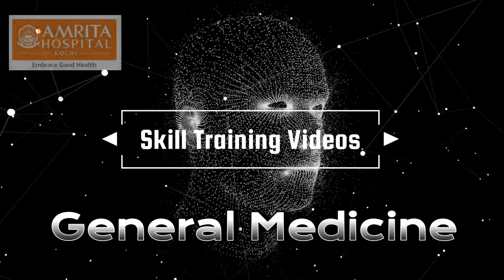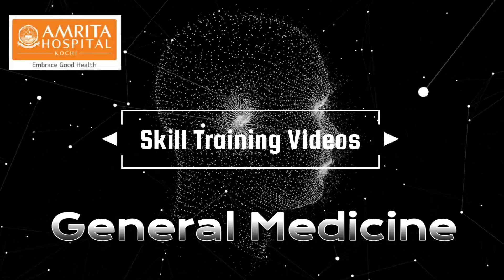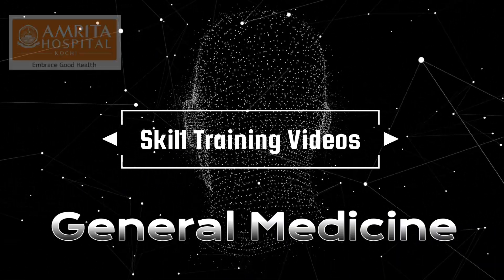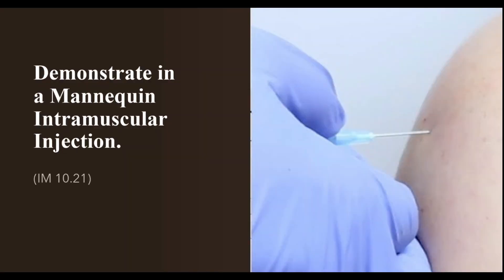Welcome to Skill Training Videos, a Department of General Medicine initiative. Today we will look into how to demonstrate a technique of intramuscular injection in a mannequin.